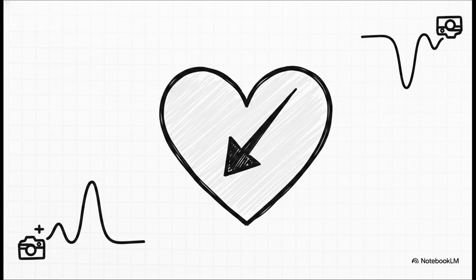The spread of electricity from the sinus node in the top right over to the left atrium creates a mean vector that points down and to the left. Since lead 2's positive camera sits down on the left leg, that vector is pointing right at it. Boom, we get a positive upright P wave. But lead AVR is sitting up on the right shoulder, so the vector is running directly away from it, which gives us a negative downward P wave.